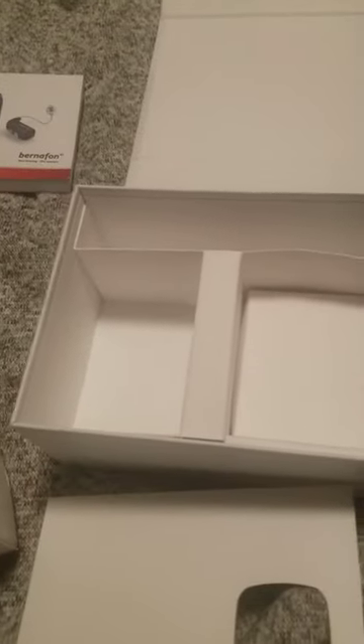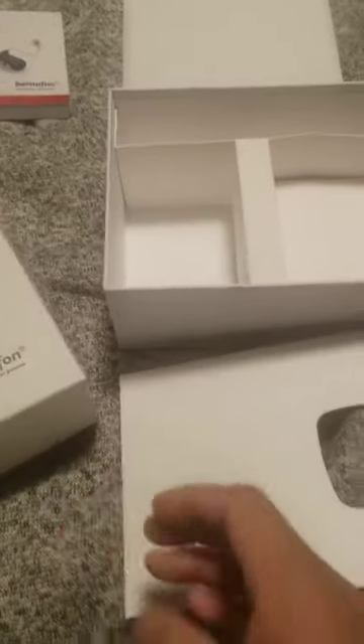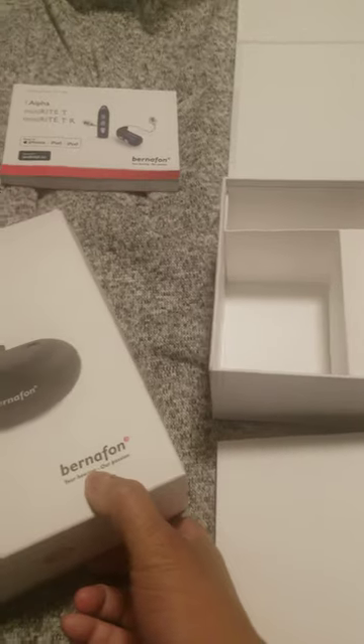There's a cleaning cloth, a tool, and a case. It's three hours rechargeable.